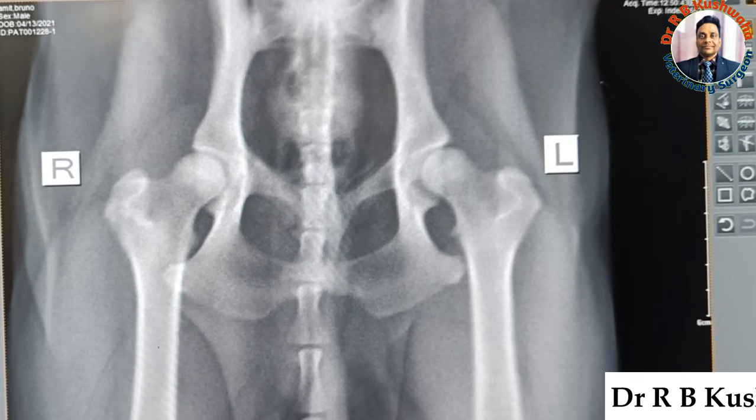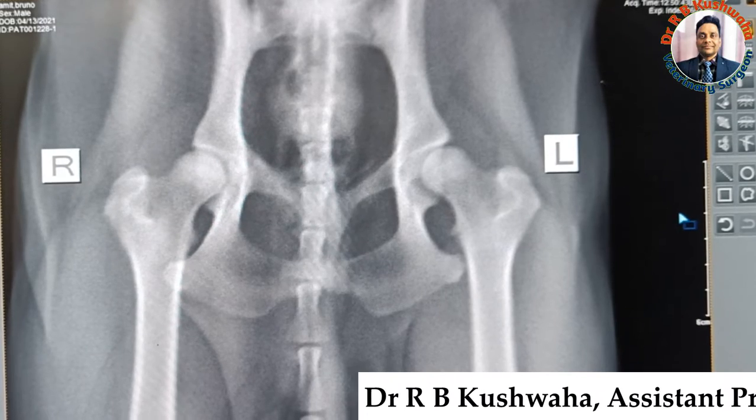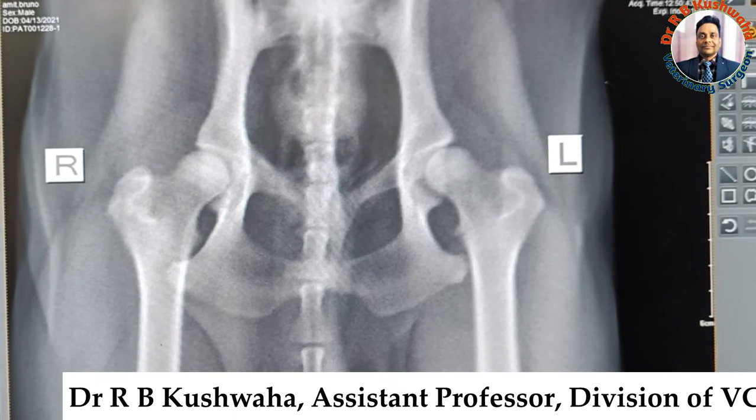Norberg's angle is very helpful in the diagnosis of hip dysplasia. This is the CR system — a software used to take the Norberg's angle. You can see here the different measurements available.